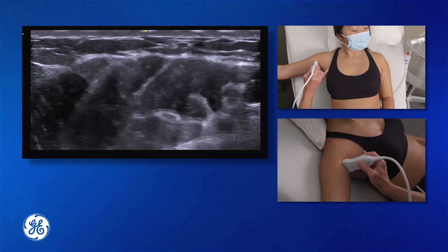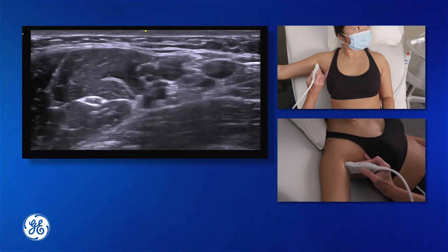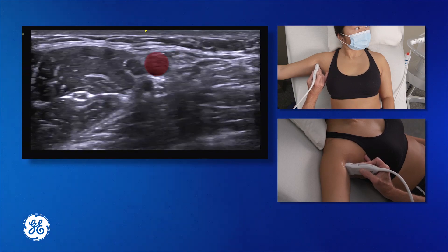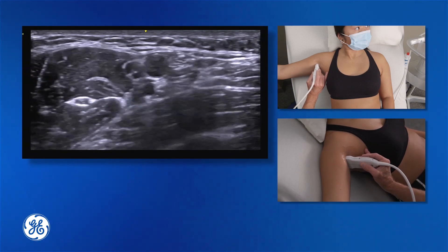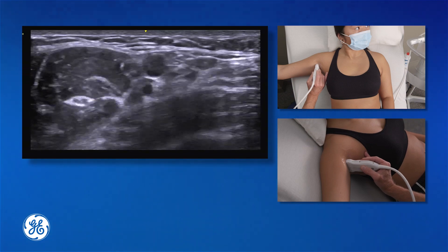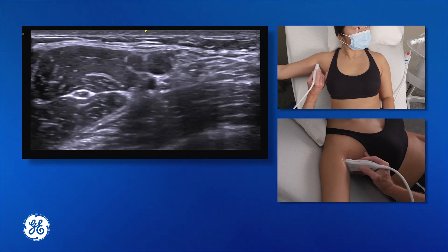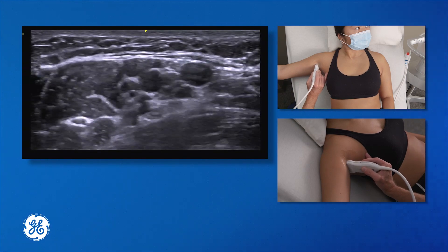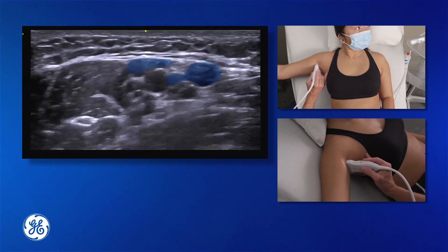We're going to take our probe, place it high into the axilla and scan until we get our optimal image. Some landmarks are going to be the axillary artery and the conjoint tendon. It's a very vascular area in the axilla — obviously at least one artery. Here we have two arteries; we have a small branch from the axillary artery. If I take the pressure off my probe, we will see various veins opening up — at least three, possibly four veins within this structure.